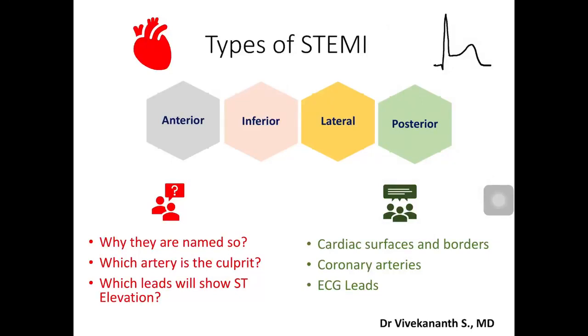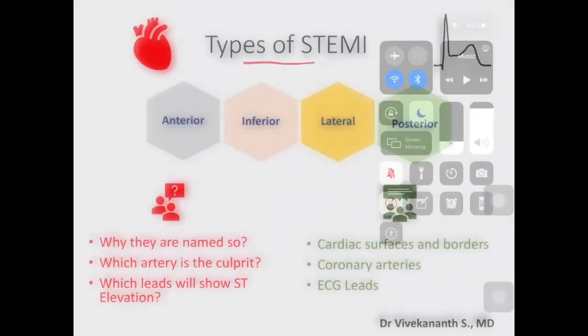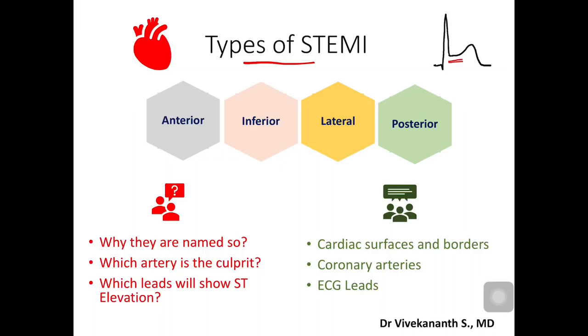Hello everyone. Today we are going to discuss various types of STEMI, that is ST segment elevated myocardial infarction. If you want to know why there is a ST segment elevation in MI, please refer to my earlier video on ST segment elevation and depression. This video will be about the types of ST segment elevation: anterior, inferior, lateral and posterior.